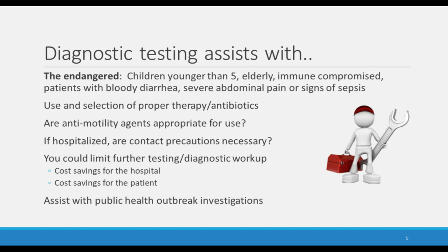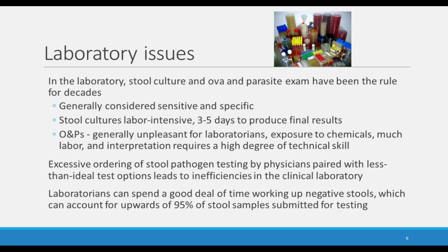If hospitalized, of course, we worry about contact precautions. Also, we could limit further testing by doing a good laboratory diagnostic testing by preventing further workup, and it could be a cost savings for the hospital and also a cost savings for the patient. Also, we can assist with public health outbreak investigations.